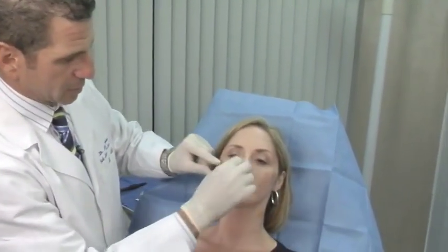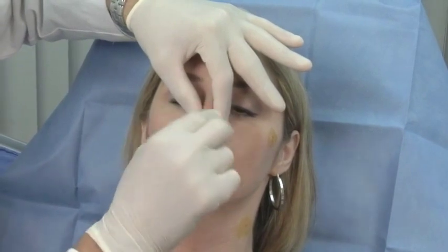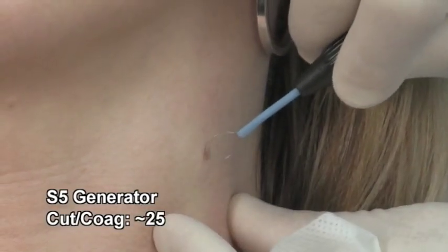The only bad part is putting a little bit of lidocaine in there — that's probably the worst part. We've marked these and they've been numbed. They can be used for AKs and seborrheic keratosis very nicely. The radio frequency does work better in a moist environment. The setting on the dual is using 25 on the mix cut and coag current. We put a little betadine on and wipe it off. You need to keep the loops pretty clean, so have a little moist sponge to clean it. We also use a smoke evacuator.